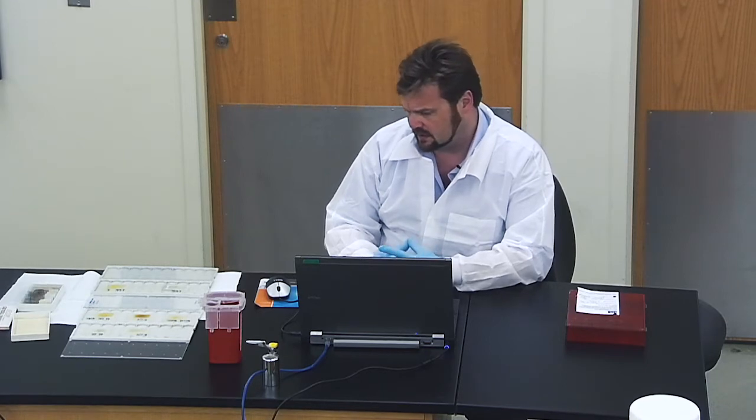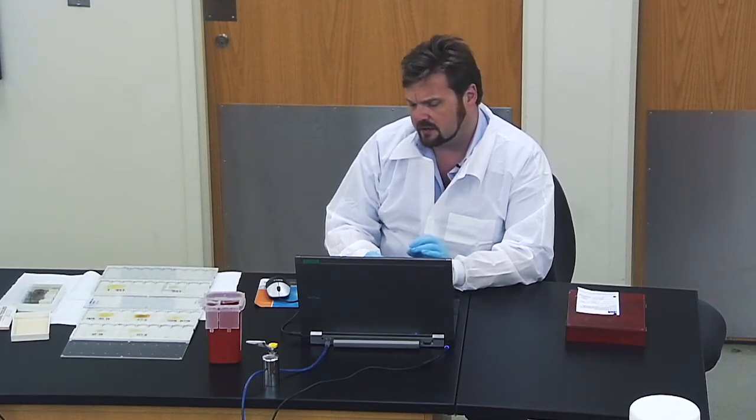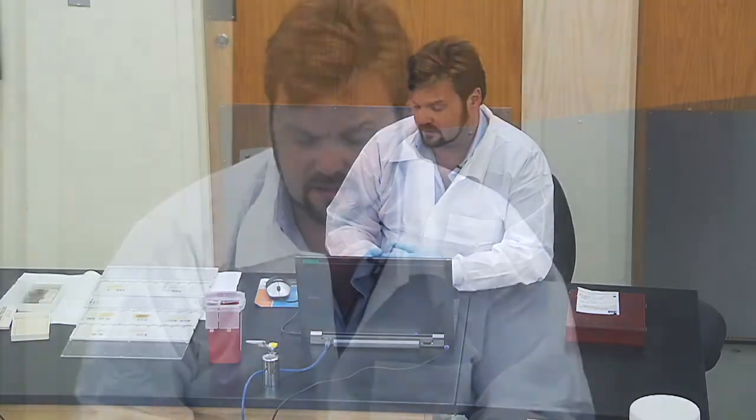So in this webinar, I want to go through and explain the different things which you need to look for to be able to differentiate the different species of Entamoeba. We're going to focus a lot on the Entamoeba histolytica complex because it is the one we're most concerned about, and Entamoeba coli because it's the one you're most likely to see after histolytica or with histolytica. But I will also talk about some of the rarer species and show you slides of those species so that you can get some idea of the morphology of them and how to differentiate them from histolytica and coli. So let's move straight along. We've got 45 minutes and we've got a lot to go through.